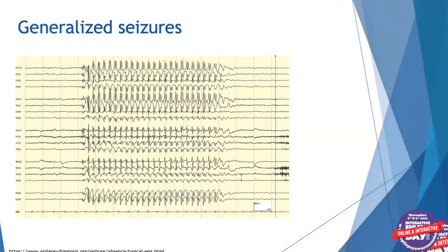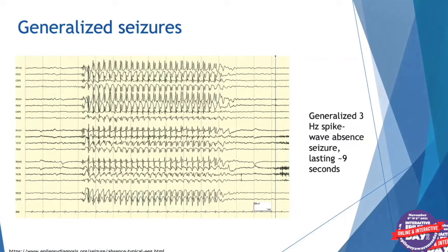Sometimes on EEGs we can see seizures, depending on how frequently they are occurring — usually on longer studies, particularly if we wean medications. This is an example of a generalized absence seizure, which can sometimes be triggered by hyperventilation or blowing on the pinwheel. It characteristically has rhythmic activity seen in every lead at about three to three-and-a-half hertz — a generalized three hertz spike and wave absence seizure lasting about nine seconds. Typically, children will stop blowing the pinwheel, stare off, and be unresponsive for the duration, then return to what they were doing. Children can have these types of seizures hundreds of times a day before they're recognized.